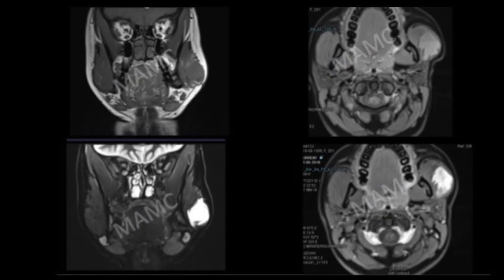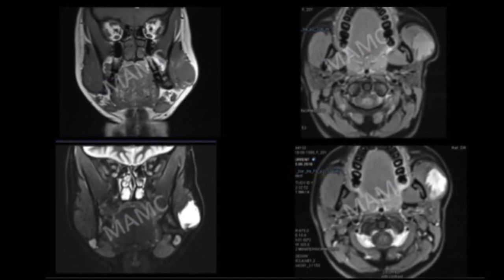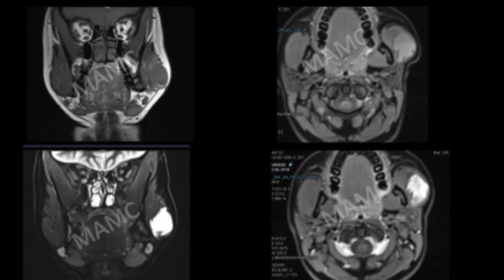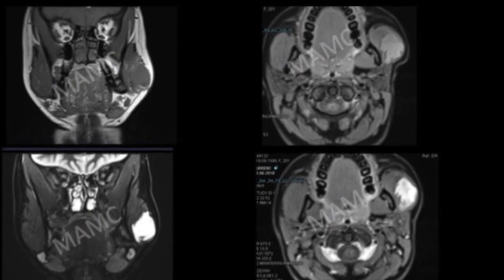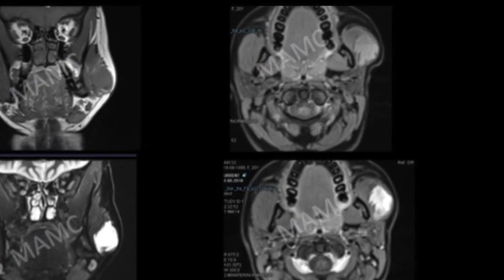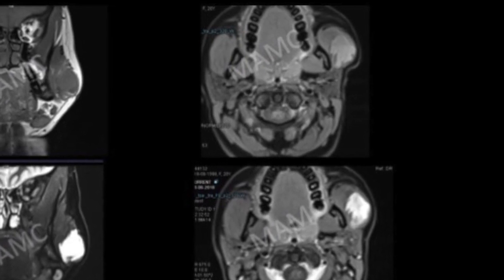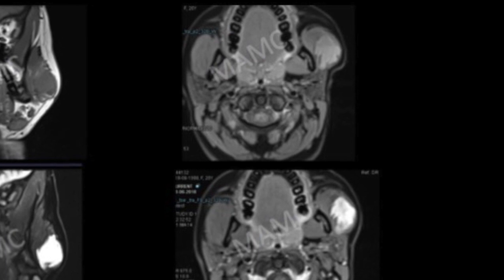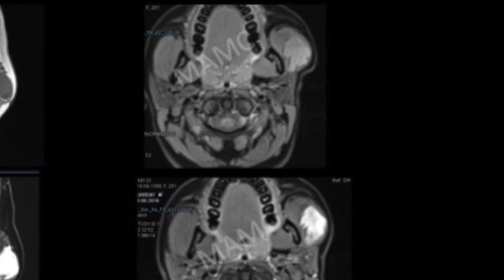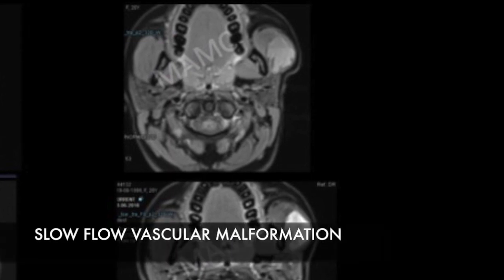A young lady presented with left-sided cheek swelling that was compressible. What we see is a relatively well-defined lesion within the left masseter muscle — hypointense on T1-weighted images, hyperintense on T2-weighted images. On contrast images, we can see progressive delayed filling, with progressive enhancement of the lesion. Fluid levels can also be appreciated. This was a case of a masticator space slow-flow vascular malformation.